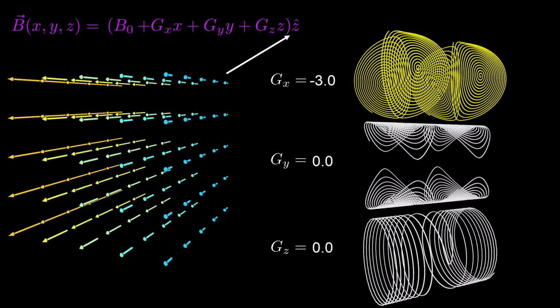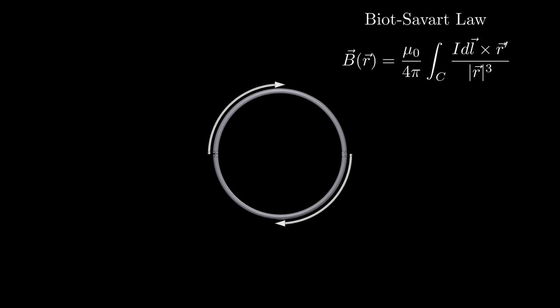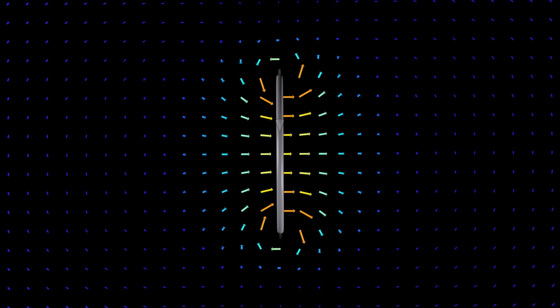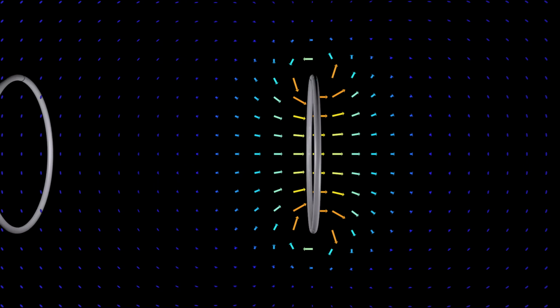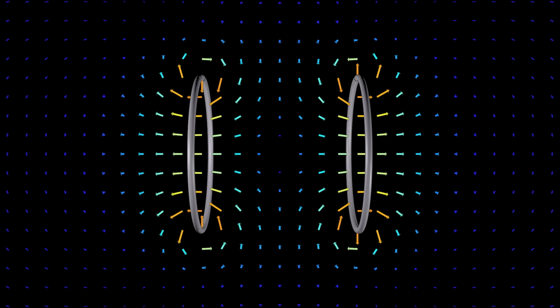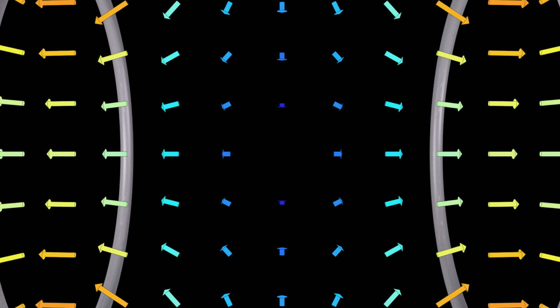Well, gradient coil design is its own subdiscipline in MRI and far beyond the scope of our discussion today, but here's a 2-bit rundown just to give you an idea. For a Z gradient, consider a single loop of wire with a current running through it like this. According to the Biot-Savart law, this current path will create this axially symmetric magnetic field near the loop. Place another loop of current coaxial to the first one and send current around this loop in the opposite direction. Now we have this magnetic field.